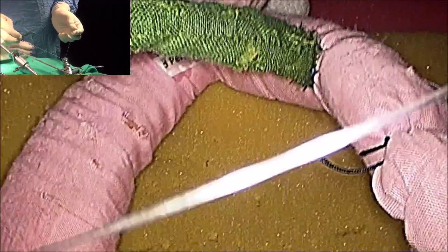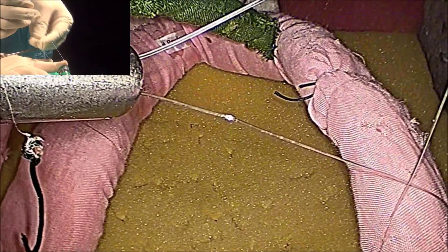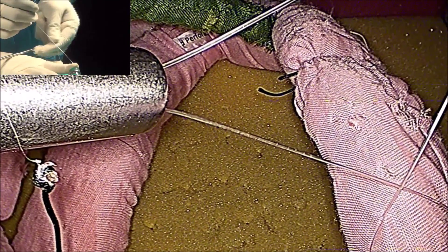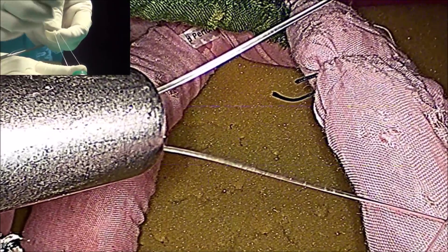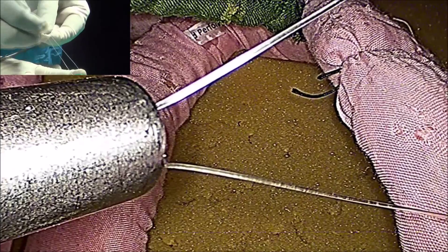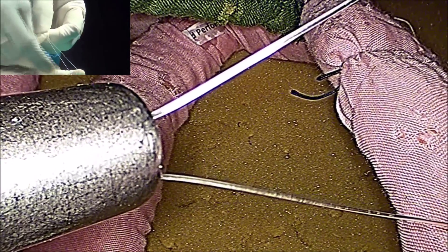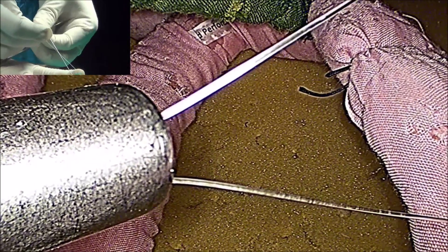Once the suture is out, you have to tie the knot. For tying the knot, you will use either 2-3-2, which is the Melger's knot, or 1-1-1-1-1-1, which is the Misra's knot. You will take — this is one hitch — then one wind, then one lock. This is one lock.